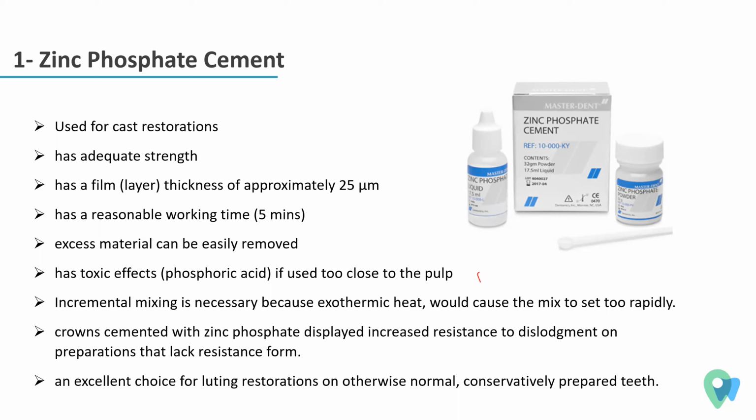Crowns cemented with zinc phosphate displayed increased resistance to dislodgement on preparations that lack resistance form. It's an excellent choice for luting restorations on otherwise normal, conservatively prepared teeth.